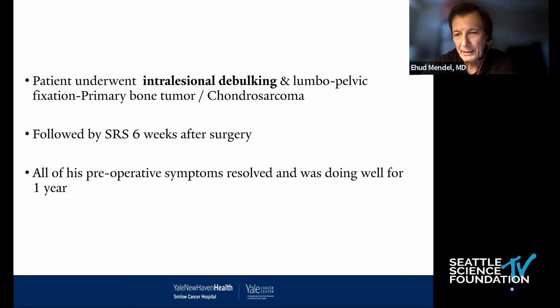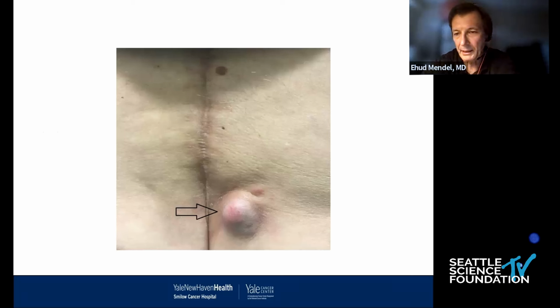And guess what? Surgery was great. All of his symptoms resolved: his bowel and bladder, his weakness, and his pain got better. He was very happy for about a year. And then he came to my clinic showing me this. He says, Dr. Mendel, I think one of my screws is backing up. I'm worried that the screw is backing up. That's what it looked like.